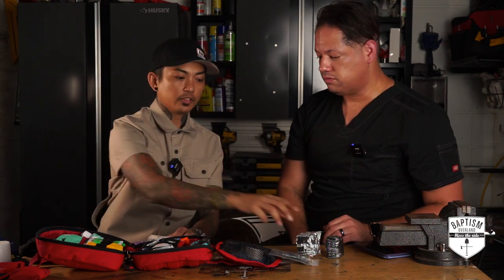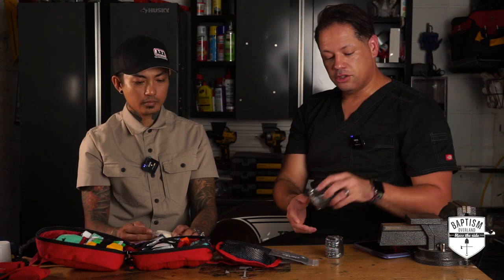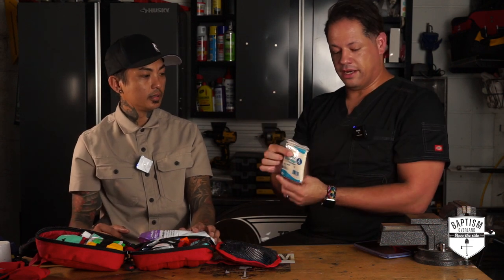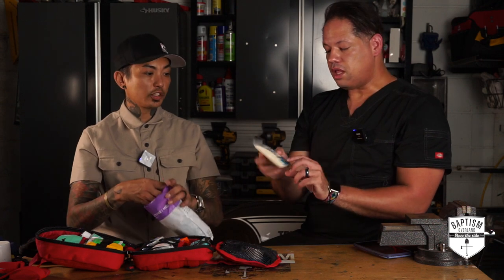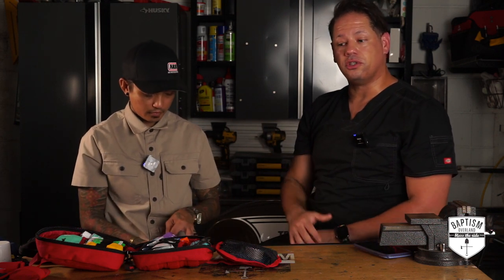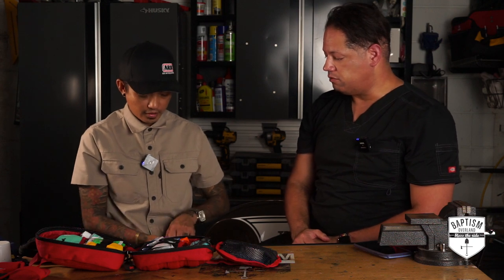What do these compression bandages do? If you need to wrap them around an extremity — your arm or your leg — to control bleeding, that's a good thing to have. There's also a triangular bandage, which you use if you want to create a splint. If you hurt your shoulder and need to splint your arm, it's shaped like a triangle so you can open it up and create a makeshift sling for your arm if you injure your shoulder or elbow.